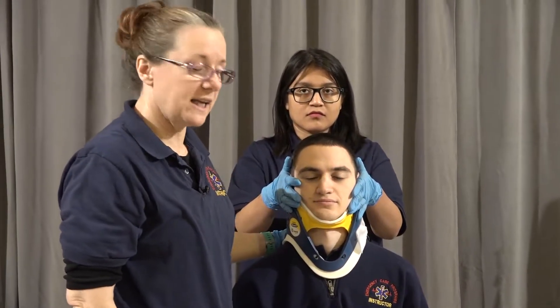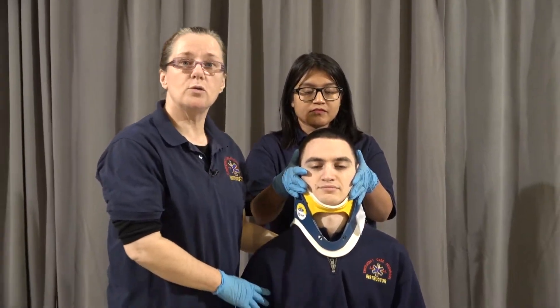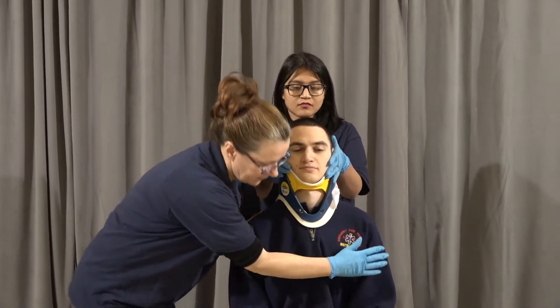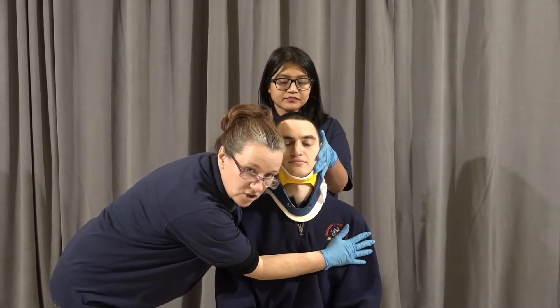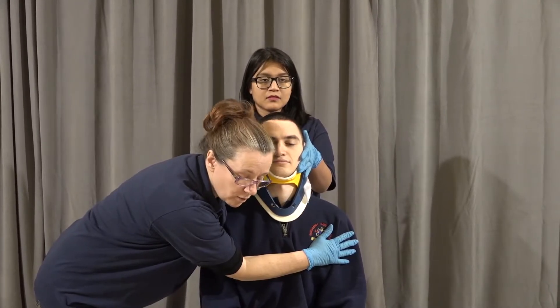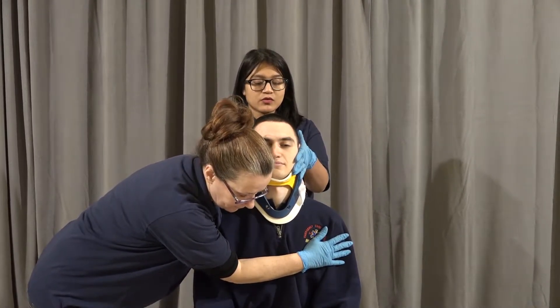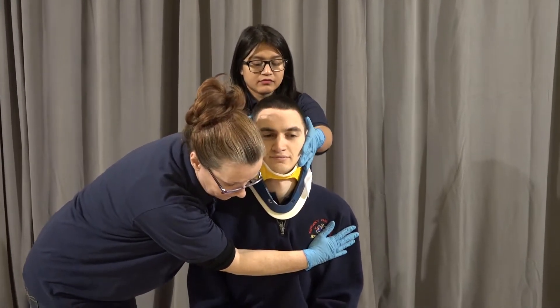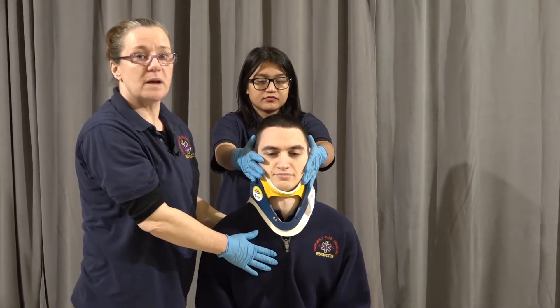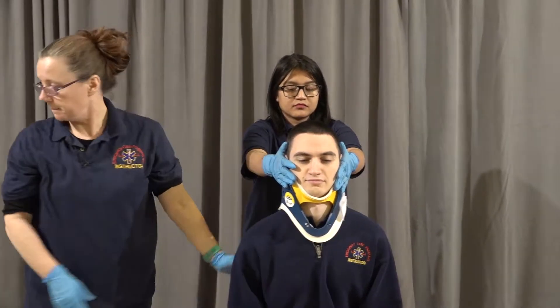We're now ready to apply the KED. The first thing we're going to do is move the patient forward, supporting the chest on the head's count. We're going to count to three: one, two, three. Try not to go past 45 degrees, otherwise the patient won't have control of their own back.